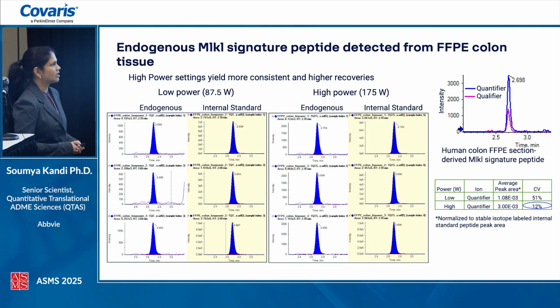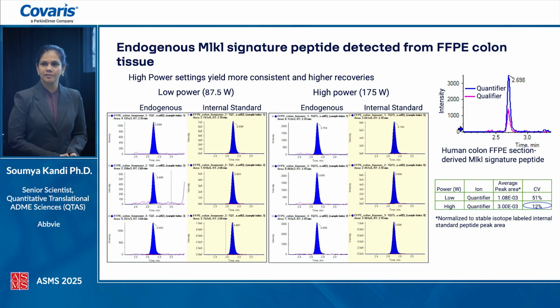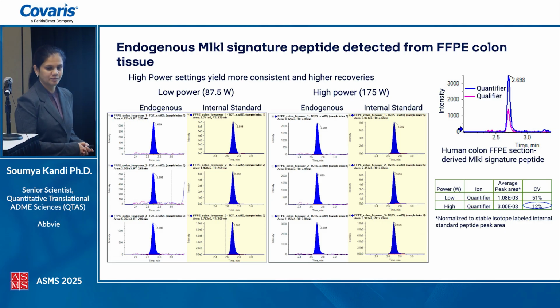And there is also a better precision. It's kind of hard to see on this slide over here, but there is a 12% precision that is associated. I do want to mention that there is a stable isotope labeled internal standard for the peptide that I'm spiking in. And both of these analytes have retention times that coincide.